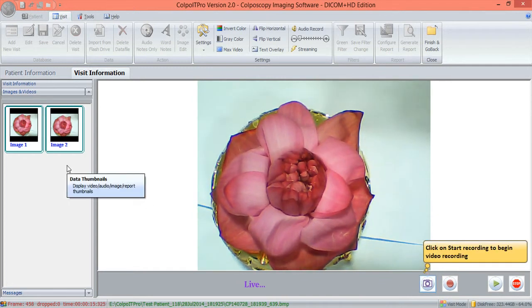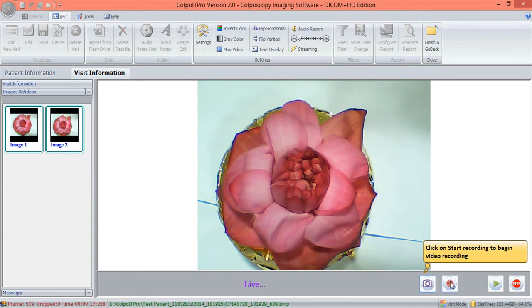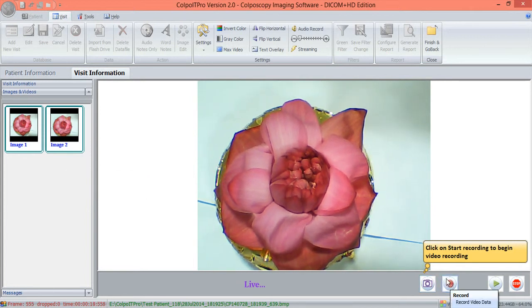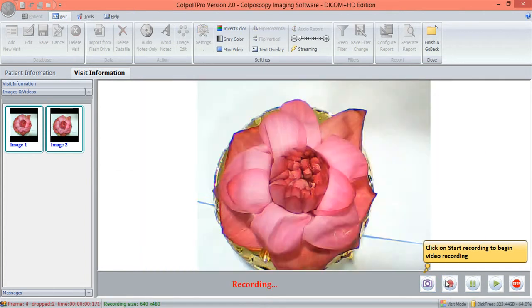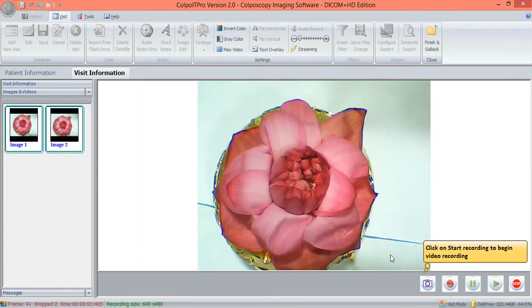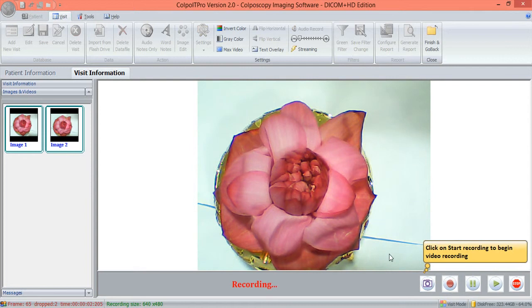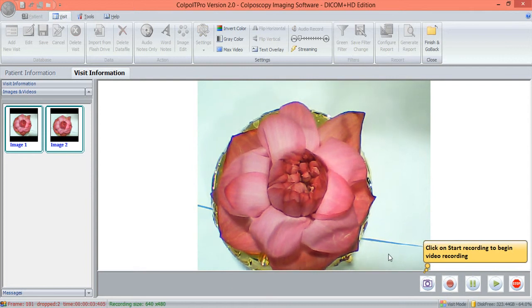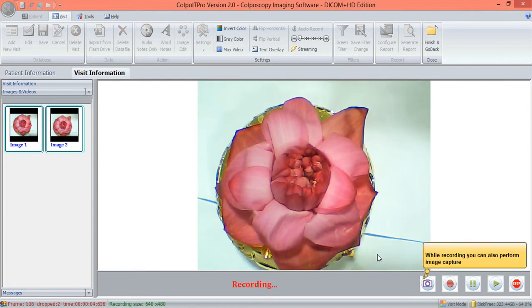Recording of the procedure can be done by clicking on the Record button. Colpo IT Pro facilitates the capture of images even while recording.